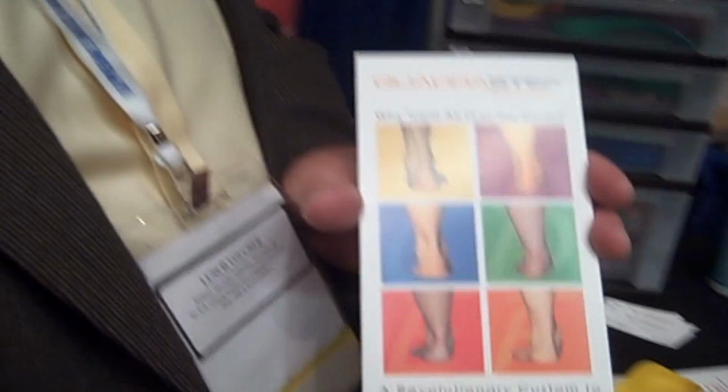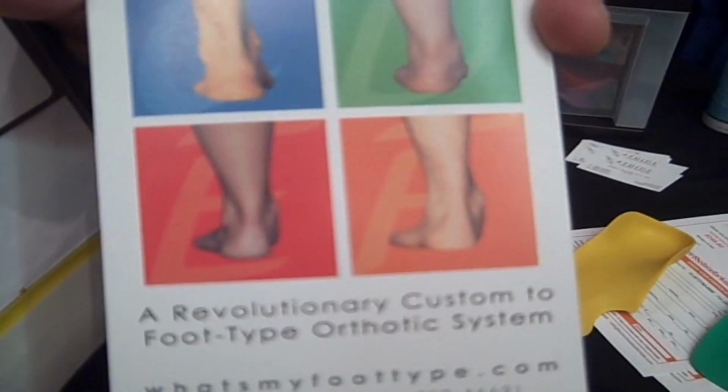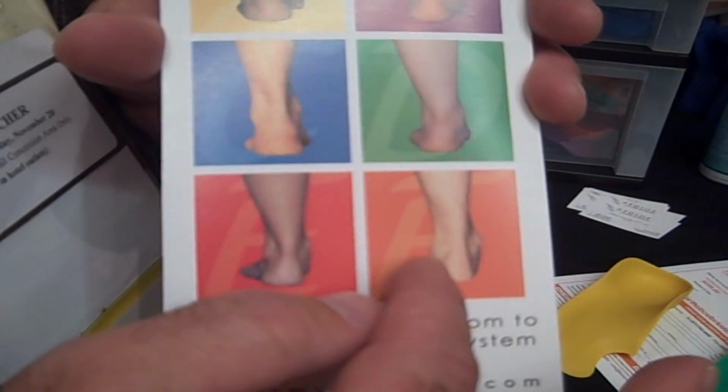Now I turn my patient around and I look to the back of the heel and I count the toes I can see on each side of the heel. In this case, I see my patient has too many toes sticking out laterally and no toes medially. So that indicates a forefoot varus. So now, based on that, I see too many toes laterally. I'm thinking E or F foot type.